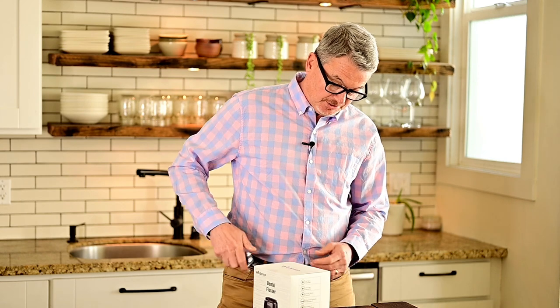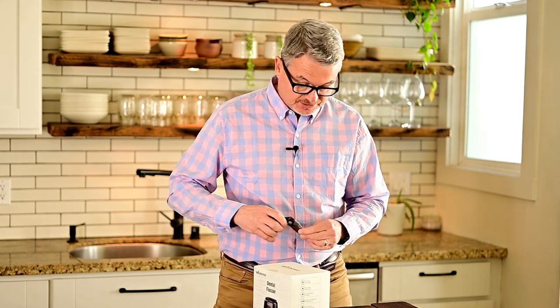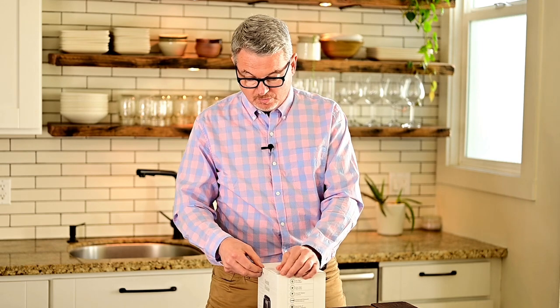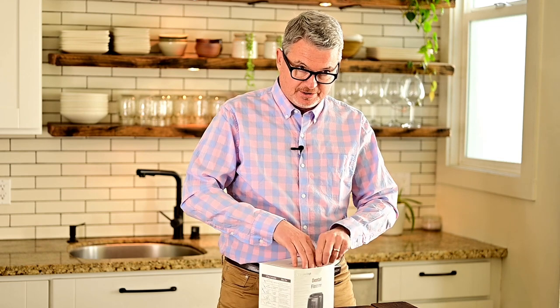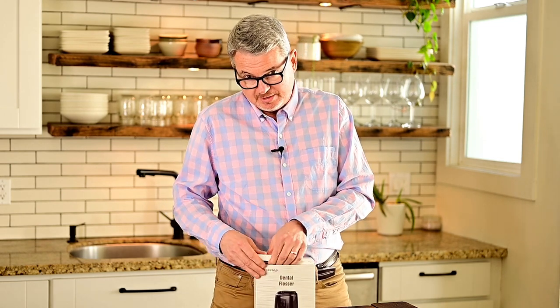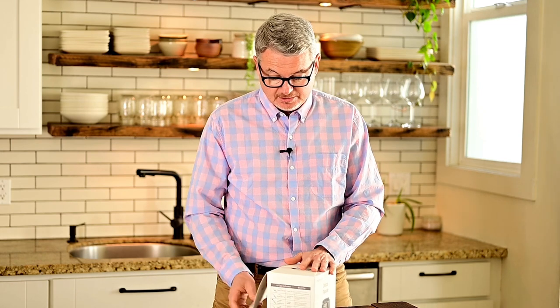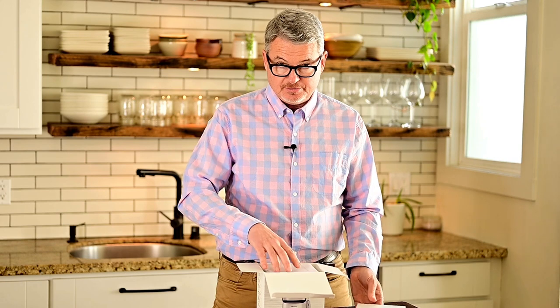So let's open this thing. This, I hear, is almost half the price of the Waterpik, which is nice. It comes in a black model — I'm not sure if I have the black or the silver chrome. I think that's nice; people want to make it look good in their bathroom. People do that with kitchen appliances — kitchen appliances come in many different colors now, people are customizing.